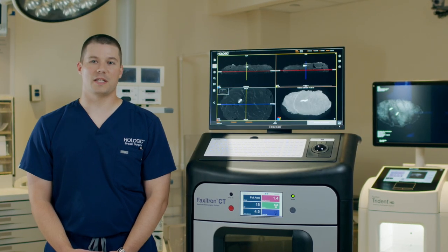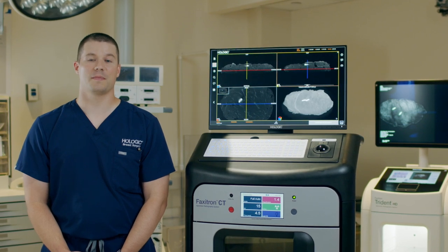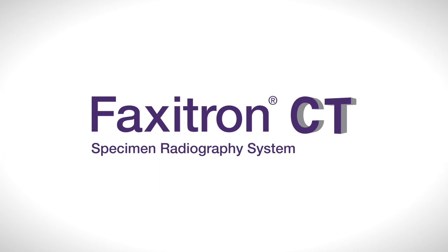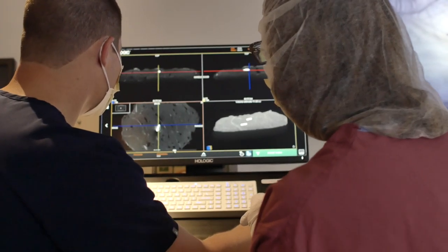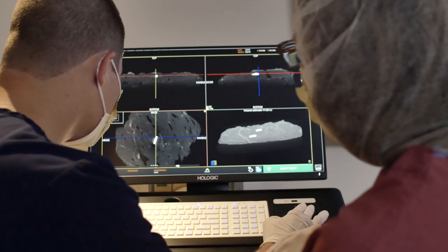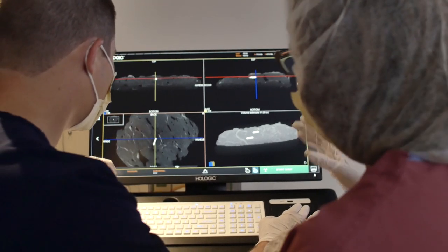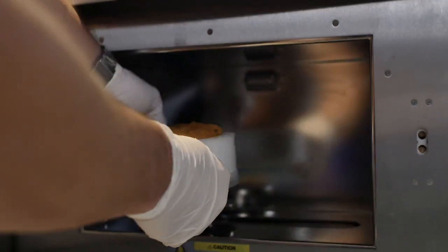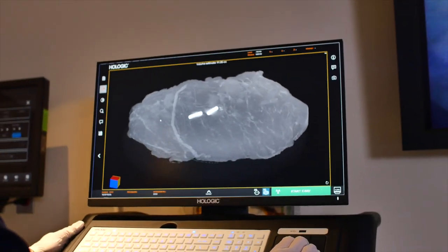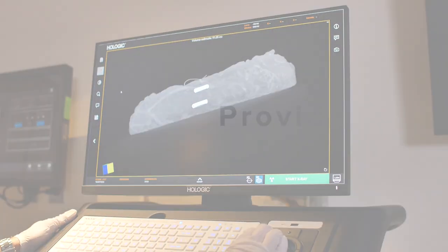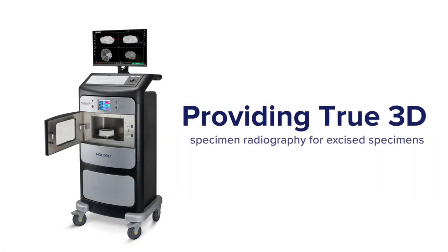The Faxitron CT specimen radiography system takes specimen radiography to the next level by utilizing specimen CT. By providing hundreds of slices from all three axial planes, the CT allows for a comprehensive analysis of surgical specimens. When utilizing post-processing tools, surgeons can identify, target, and evaluate areas of interest with the first FDA-cleared micro-CT, providing true three-dimensional specimen radiography for excised specimens.